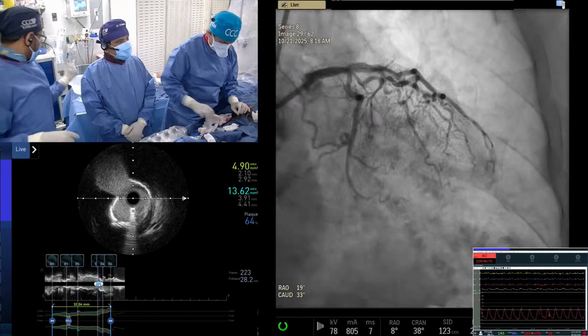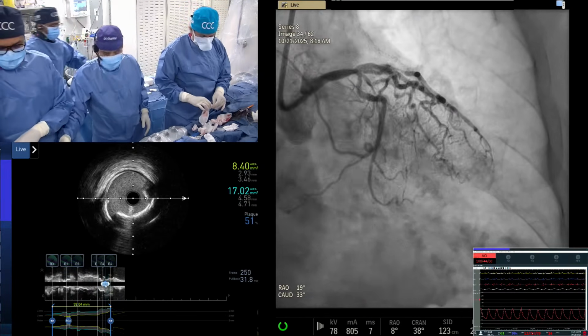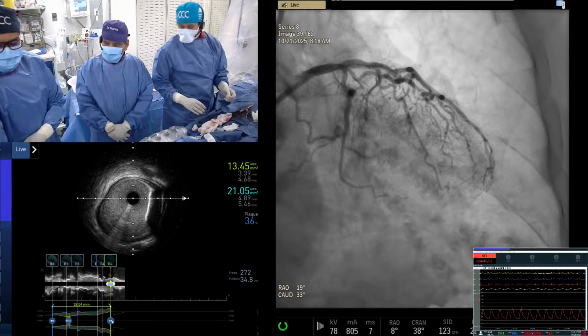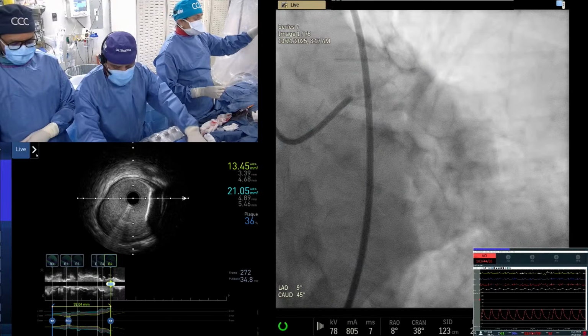38. Yeah, that's fine. 38 may be too long. He is saying 24. That's to the ostium. 33. To the left main is going to be 32. Not 32. 33. Okay, they give us the first the side branch. Let's get a picture and let's get a side branch.